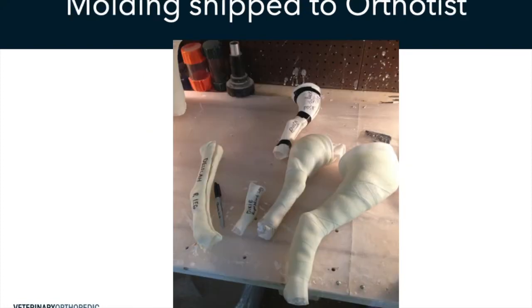All right, then what's the next step? So you saw, that was Derek Campana, an orthotist from Northern Virginia that we work with very, very closely and frequently. And what you saw was the cast mold of what we call the distal extremity, which is the area of the stump. And now what's going to happen is he slides off that cast mold, he's going to take it back to his shop, and then he's going to go through a step-by-step process. It's fairly technical to actually create the final device. So Derek was kind enough to walk us through this process.